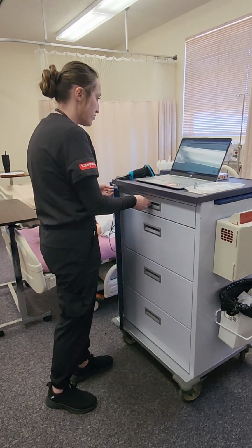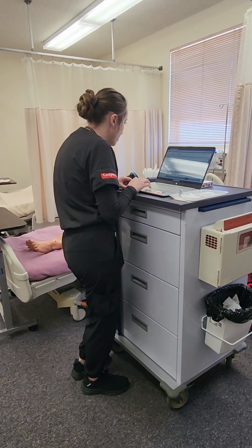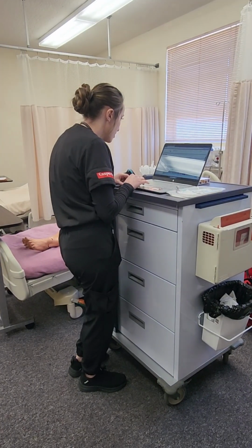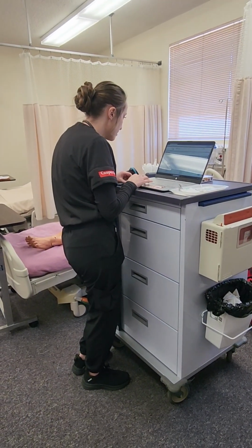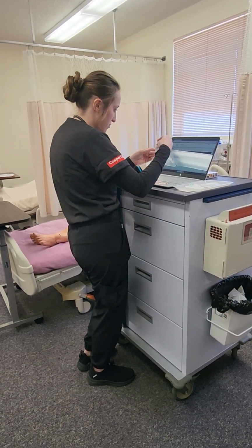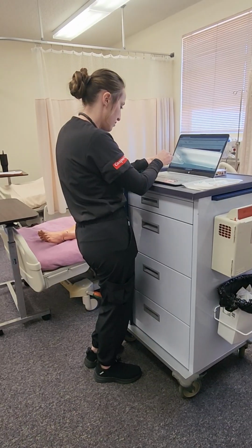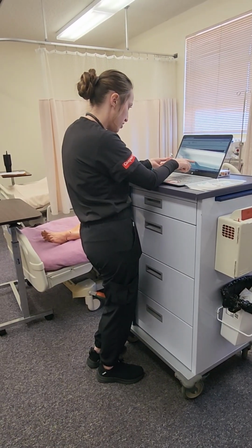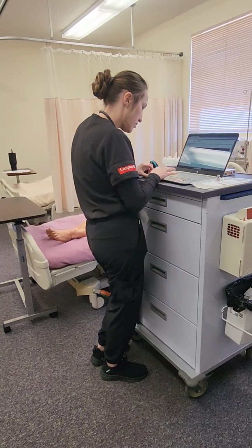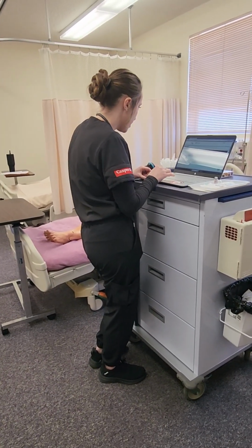All right, now I'm going to do my first med check. I have Myla Bush, date of birth 3/28/1945. She's allergic to indomethacin. She is due for her heparin sodium. This is 1,000 units per 1 ml. She will receive 500 units, which is 0.5 ml, every 8 hours subcutaneously. She is due for this at 2:37 p.m.